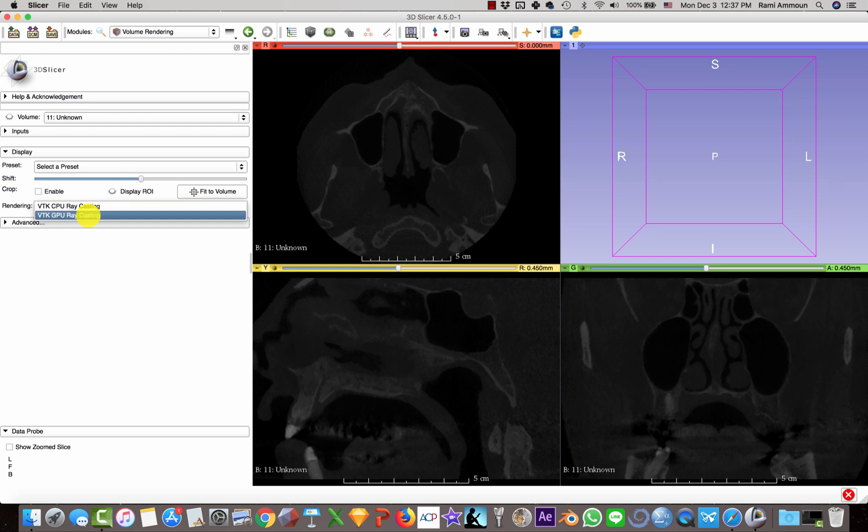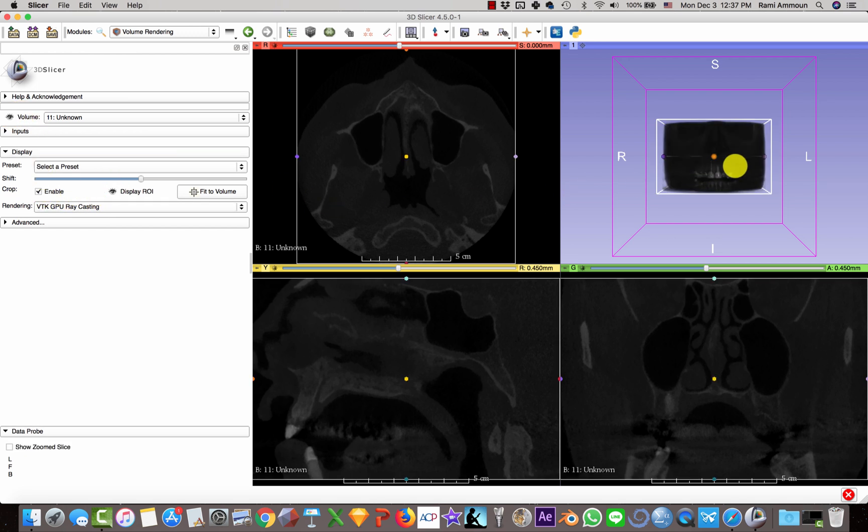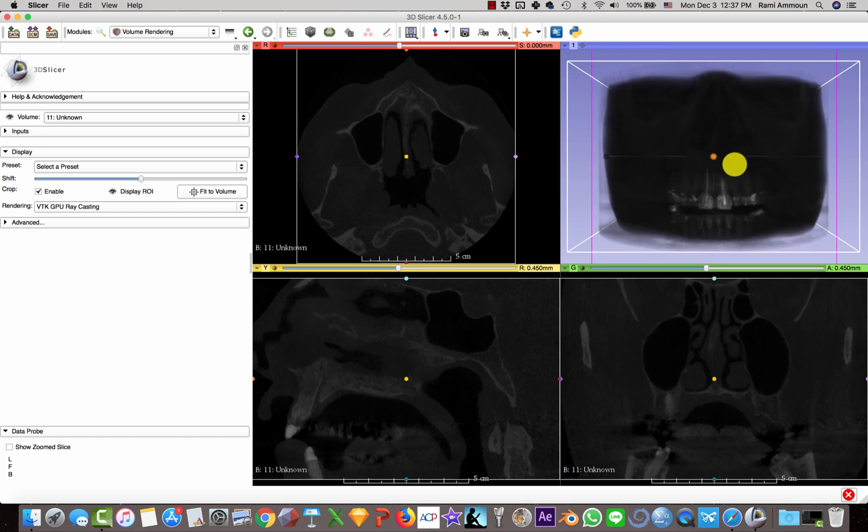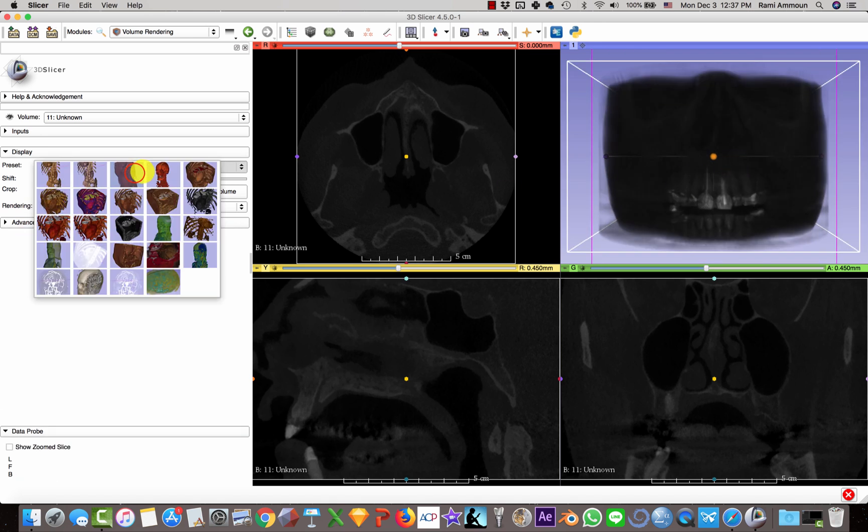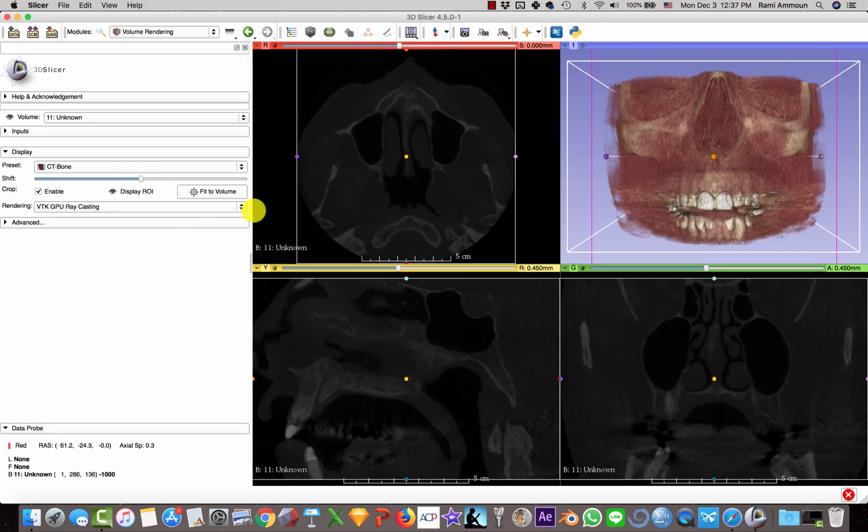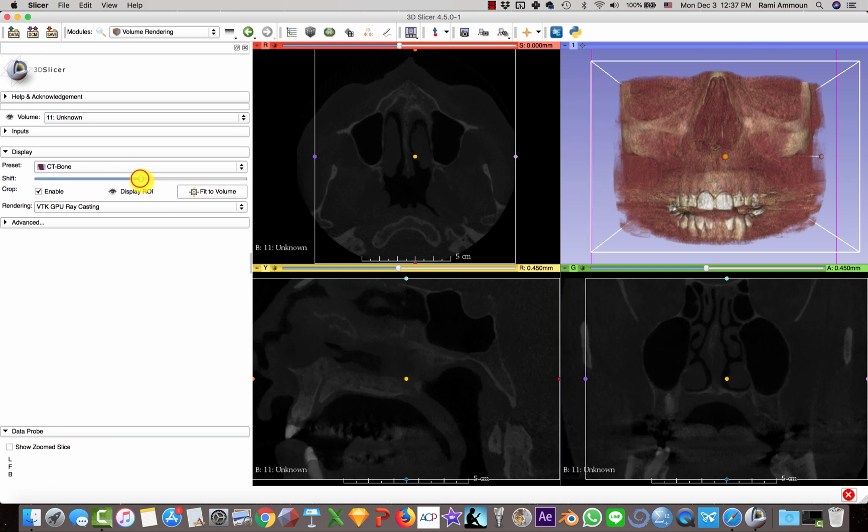Enable the volume and select the CT bone preset, and adjust the shift.